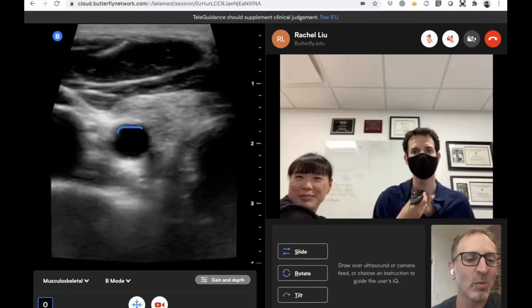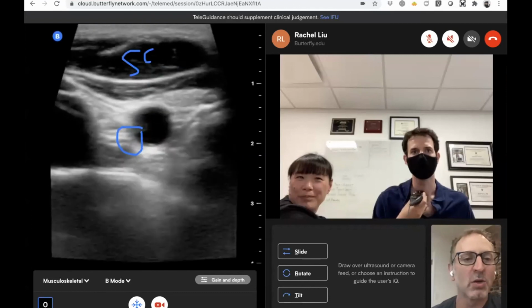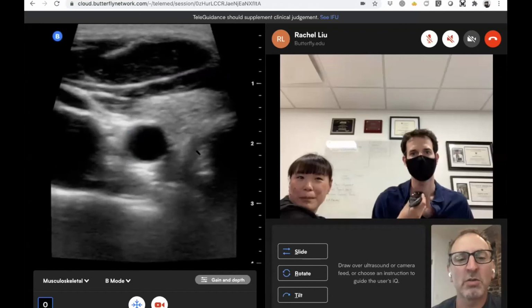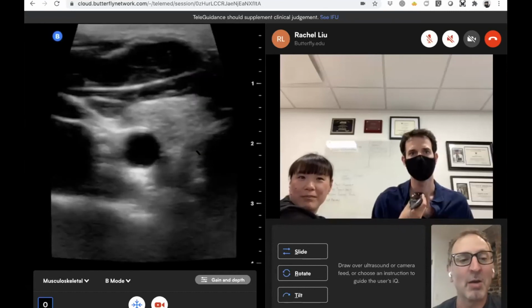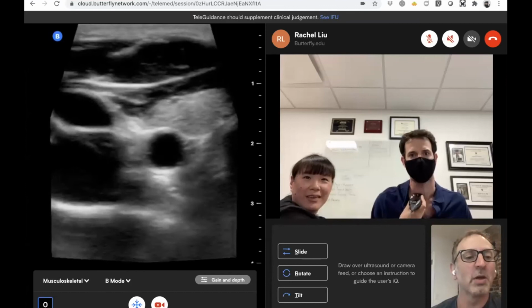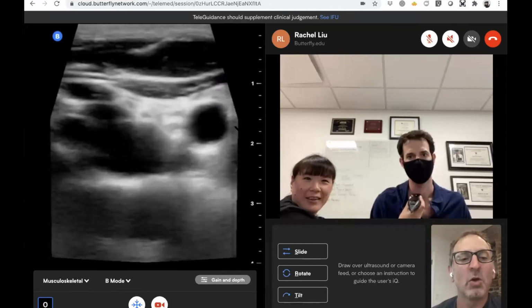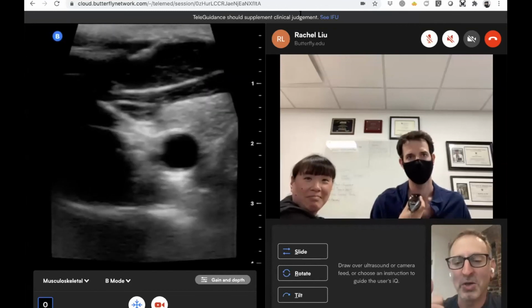But right here we've got the carotid artery, and the sternocleidomastoid up there. We're not seeing his internal jugular vein because he's standing upright, but if you want to try a Valsalva, we might be able to see your vein pop out. Yep, okay, there we go, right there. So there's the IJ. If you ever need a central line, you've got a lot of distance between your IJ and your carotid, so you'll be in good shape.